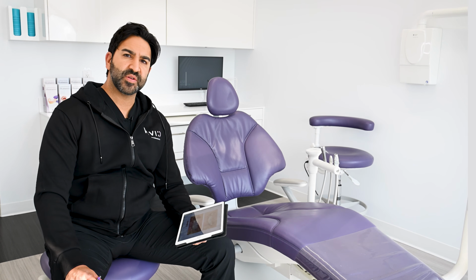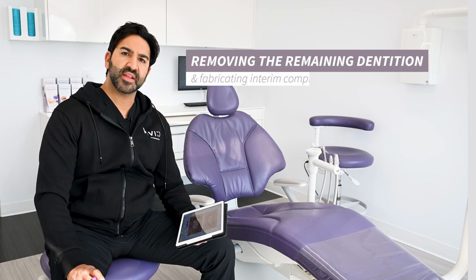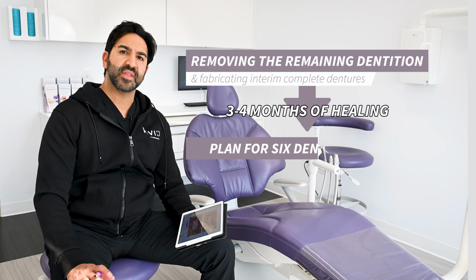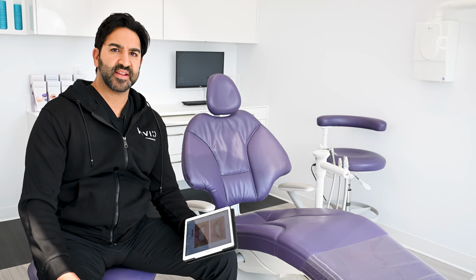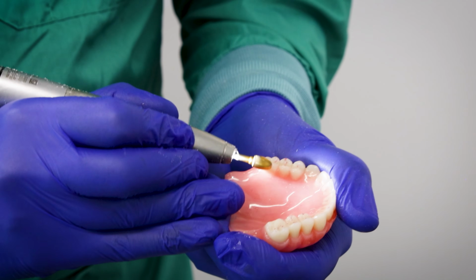The first phase of treatment involved removing the remaining dentition and fabricating interim complete dentures for the upper and lower arches. After roughly 3 to 4 months of healing, we then planned this patient for 6 dental implants in the upper arch and 6 dental implants in the lower arch. Today's denture materials have great aesthetics, wear resistance, and strength, making them a good long-term solution.